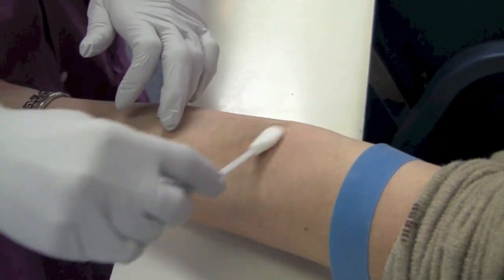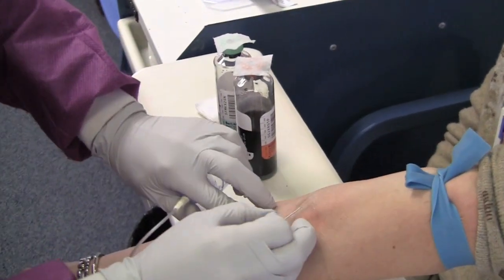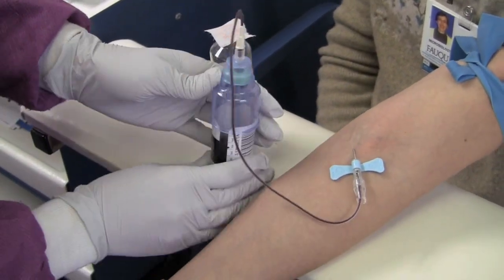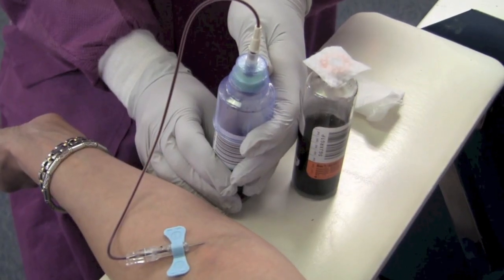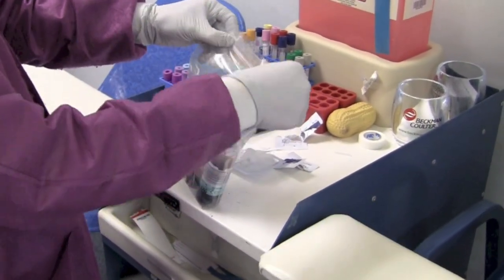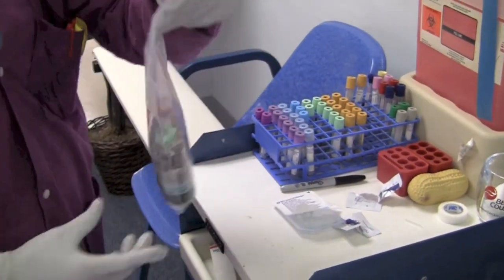In this second example, we have a patient that has been suffering from high spiking fevers. Blood is drawn from the patient and into a blood culture bottle. Once the blood cultures have been obtained, they are placed into a bag for transport.